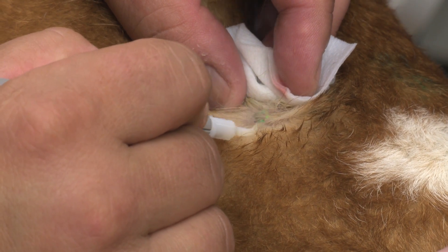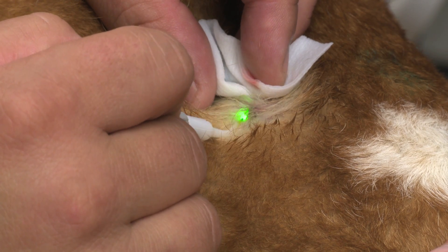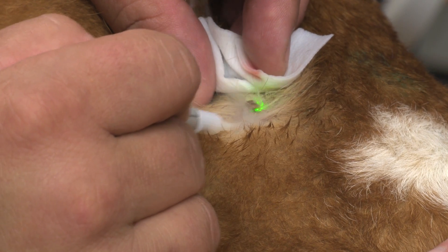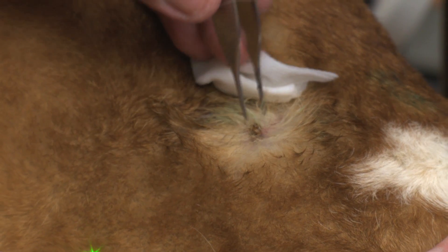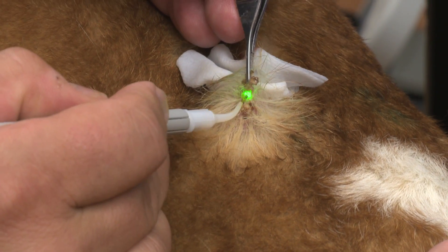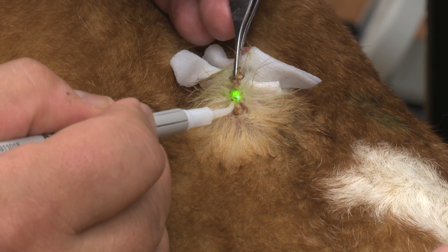You can see the beam going underneath the tissue. We're going to try to basically resect it, even though it's sessile. The beauty of the diode laser is that I can just get right underneath that, and it takes me seconds to remove this.